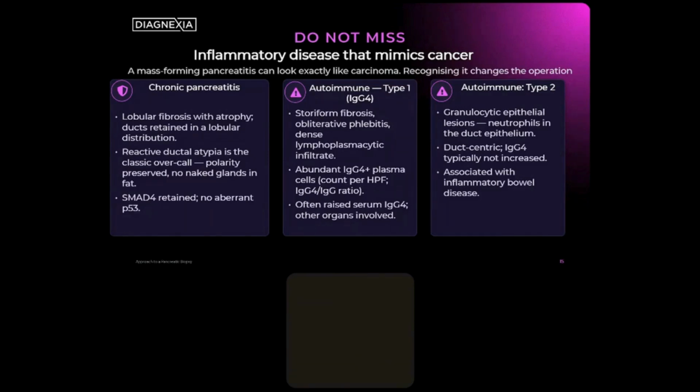And then when you start to think about that, you do an IgG4, and you do an IgG as well, do the ratios, and then you can even check the serology. So it spawns the diagnosis of an IgG4-related disease rather than an IgG4 autoimmune disease. And that has a constellation of other clinical features that the clinicians put together. So your suspicion is also heightened if the patient has autoimmune diseases in other sites as well.